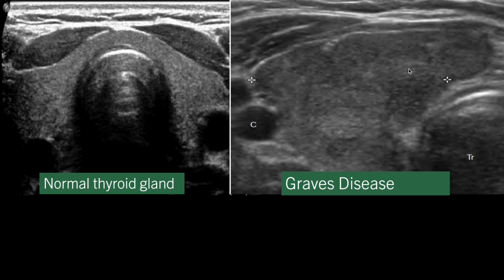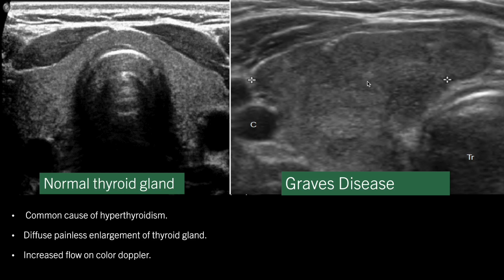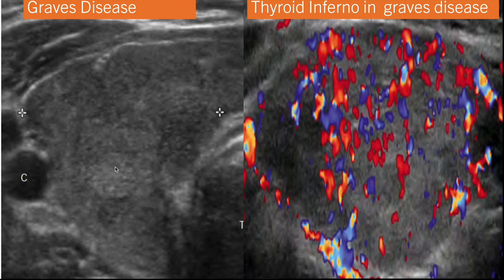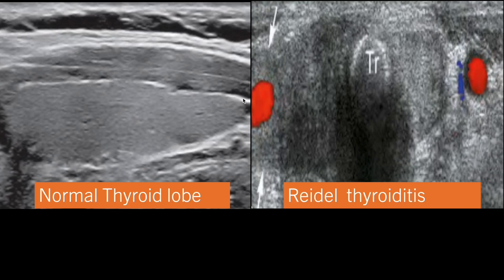Another important disease is Graves' disease. As we know, Graves' disease is the common cause of hyperthyroidism. On ultrasound, the thyroid gland is diffusely enlarged and the echotexture is heterogeneous. On color Doppler, increased flow can be appreciated. There is a specific color flow pattern called 'thyroid inferno,' which is seen in Graves' disease — when color Doppler is applied, this characteristic pattern is observed.